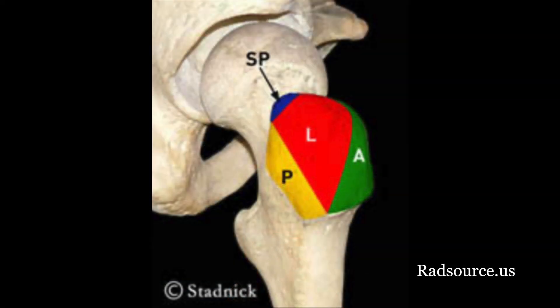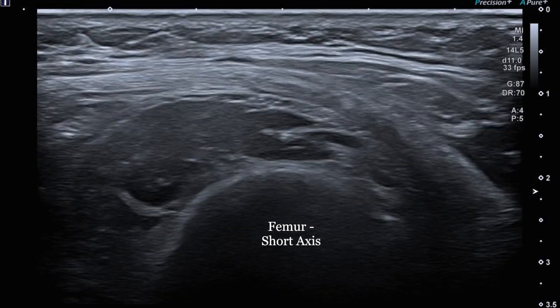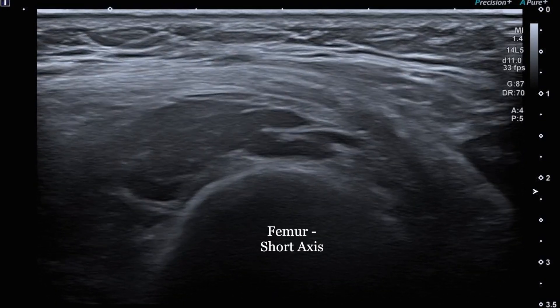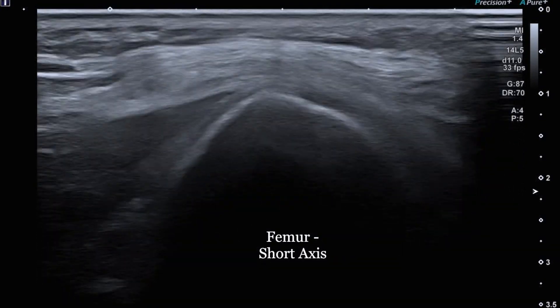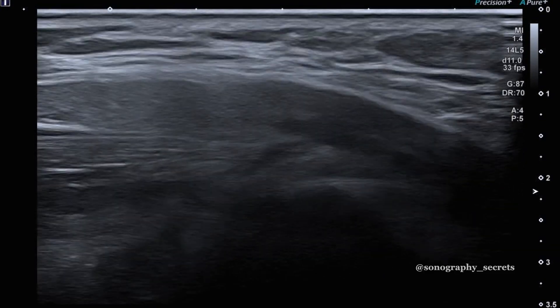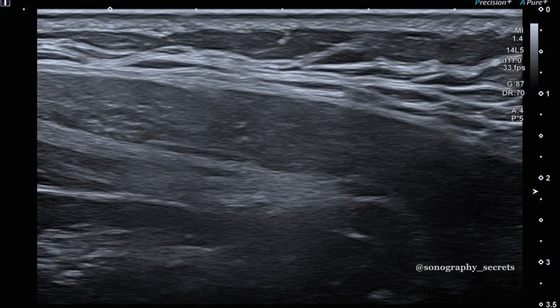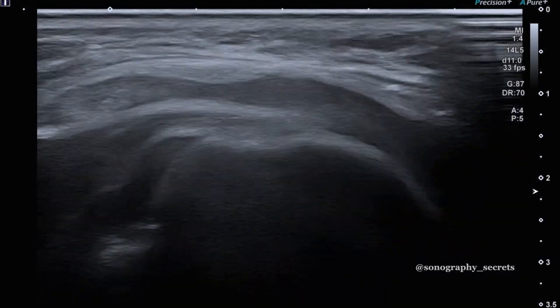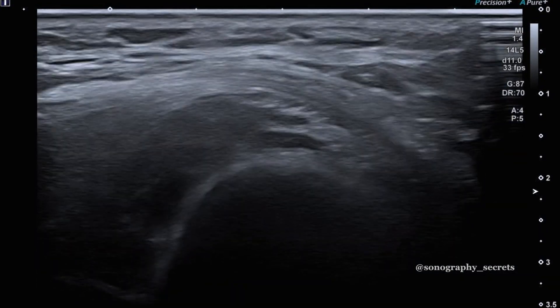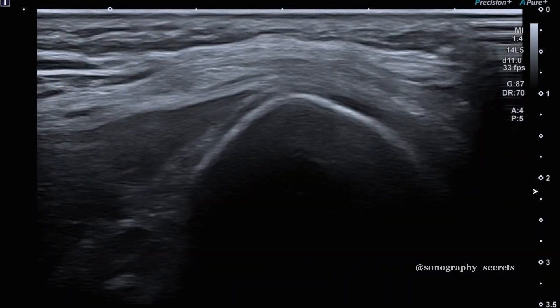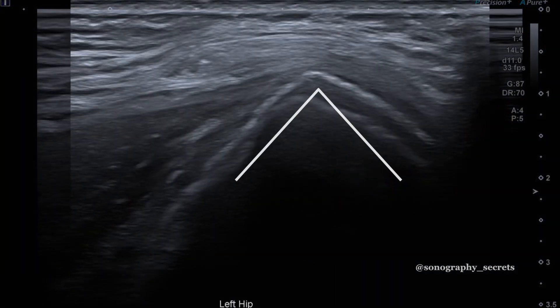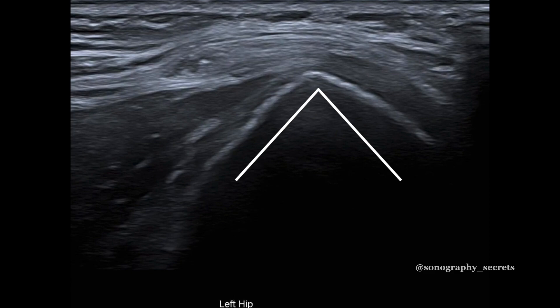The first method uses the facet anatomy of the trochanter. With the probe in short axis to the femur, if we see the femur flat, we're too low. If we don't see the femur, we're too high. So we want to scan up and down the femur until we see the peak of the trochanter.